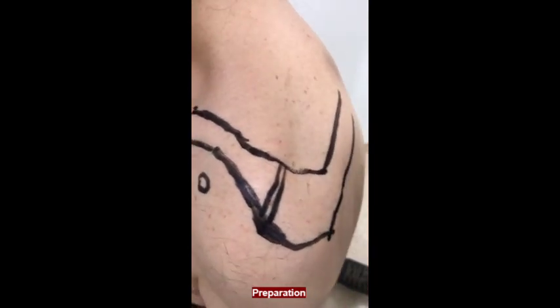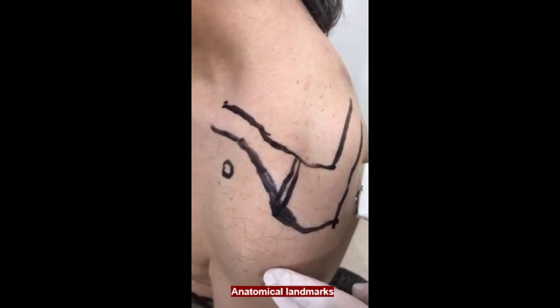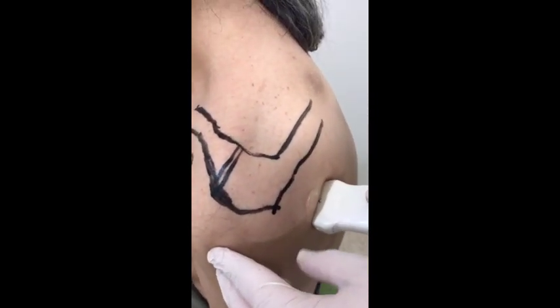The patient sits in an upright position. Anatomical landmarks are drawn, including the clavicle, spine of the scapula, acromion, and coracoid with a skin marker.